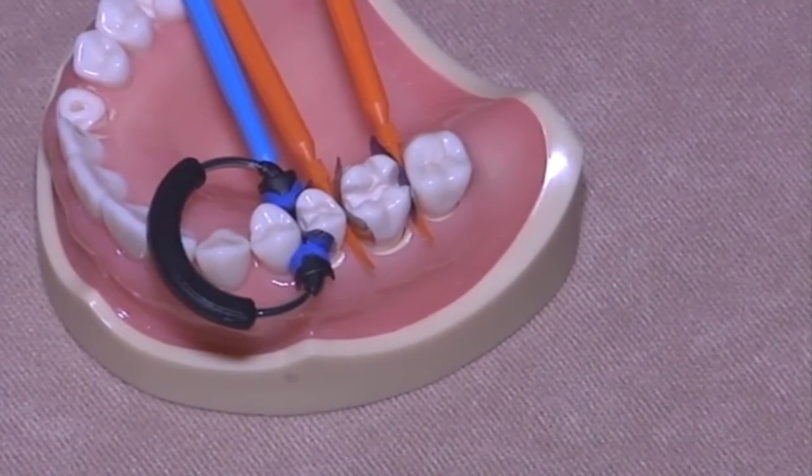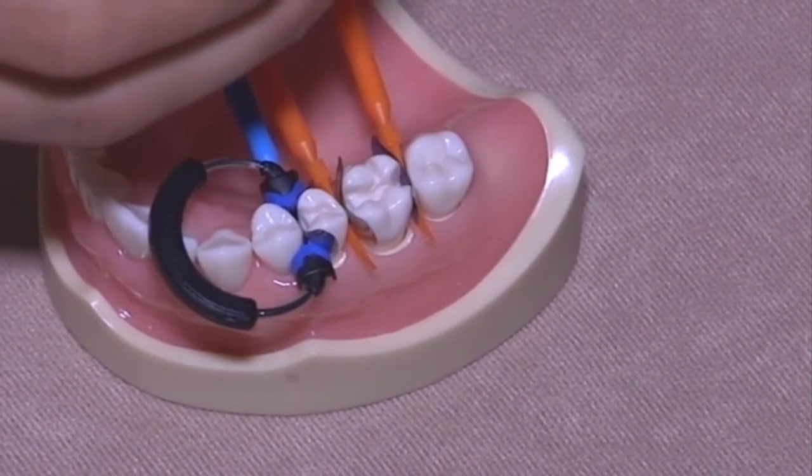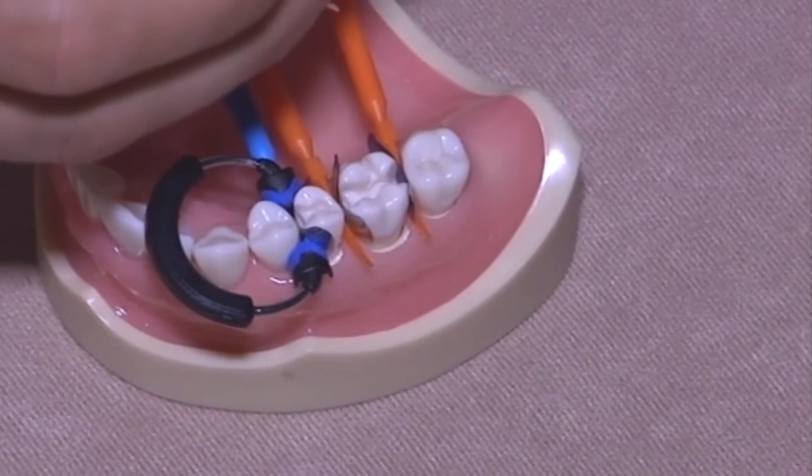and so you could have a lot of problems of post-op sensitivity. So independently of which cavity you begin to fill, we can use bonding resin on both.